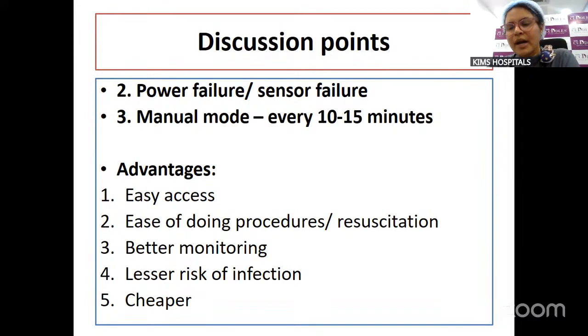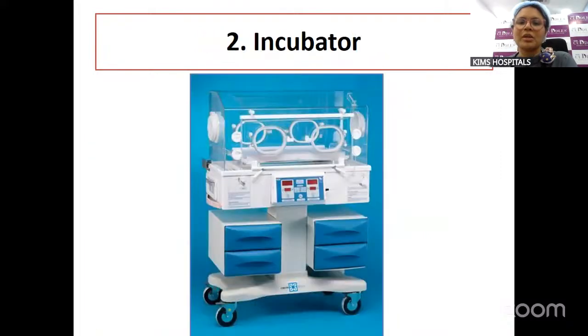Now, does the radiant warmer have advantages over the incubator? Some common advantages that the radiant warmer has include easy access, wherein we can monitor the baby and examine the baby more often. There is also a certain ease of doing procedures and ease of doing resuscitation. There is better monitoring available for the baby's clinical status. Lesser risk of infection is one of the putative advantages, although even with incubators, if we take adequate precautions and asepsis, infection should not be an issue. And radiant warmers are obviously cheaper than incubators.